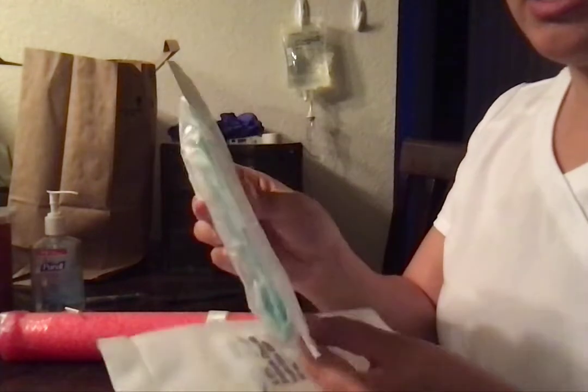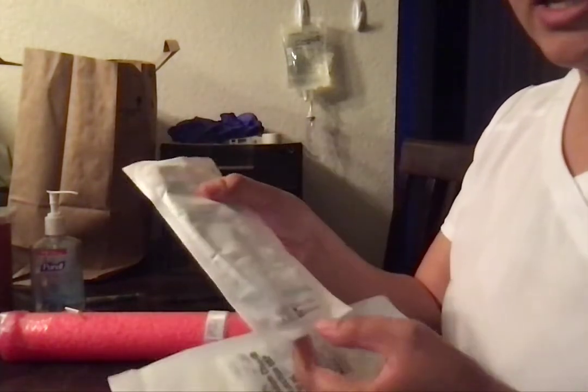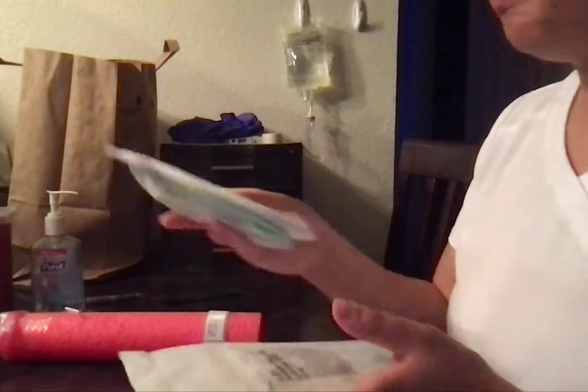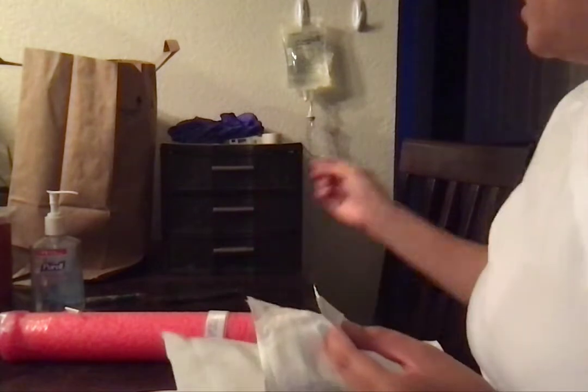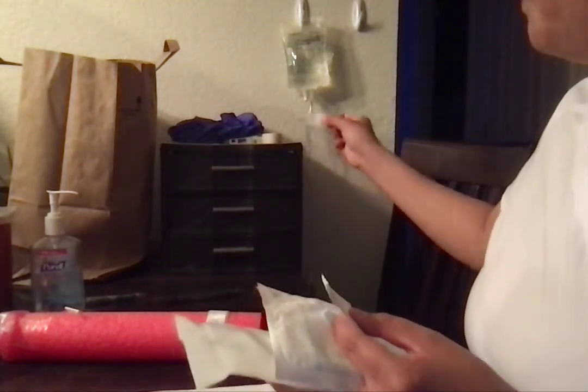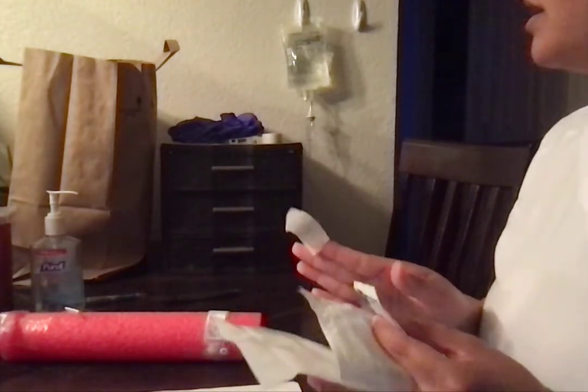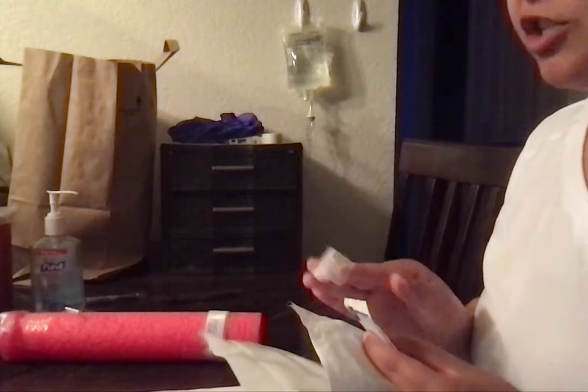The secondary line is completely intact. There's no perforations. It is within the expiration date, and it is the correct drop rate. And I'm going to get an alcohol swab to wipe the port and a label for when I hang the medication. Okay, now that I have all my supplies, let's go ahead and go see the patient.